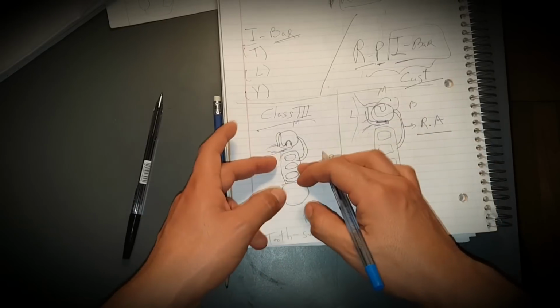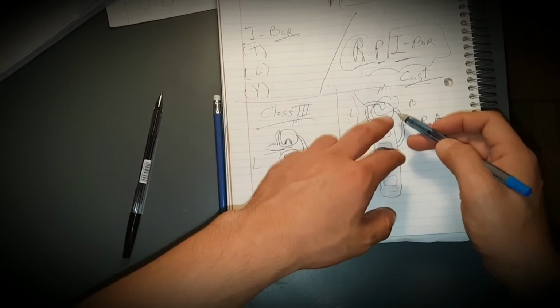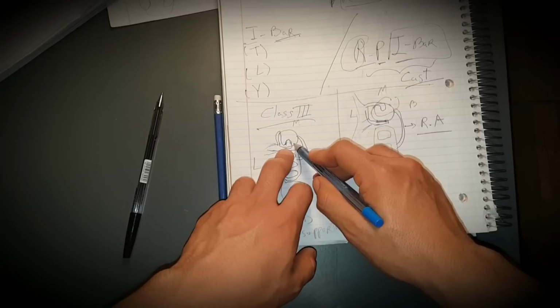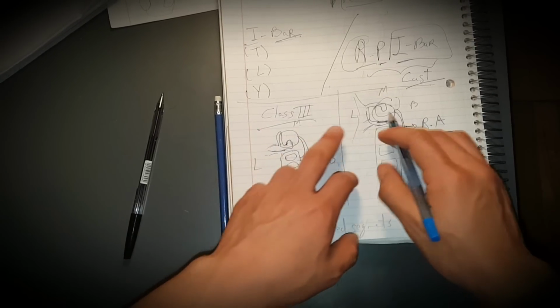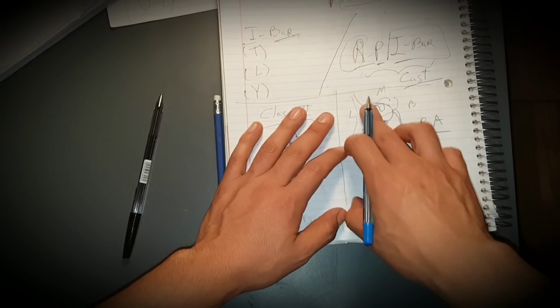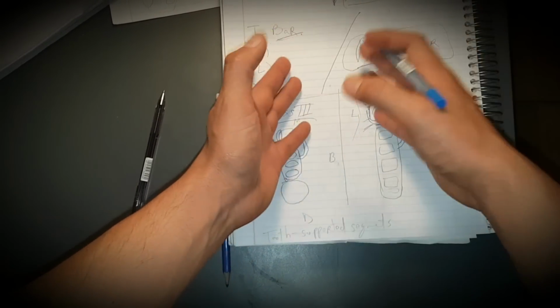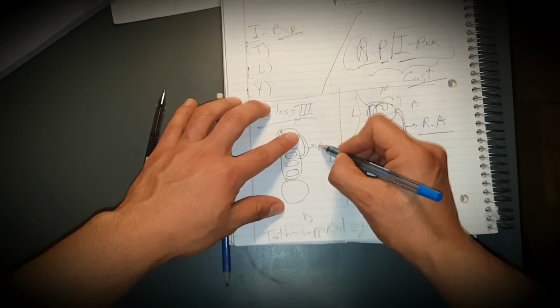So, this is not an RPI, because the R means that the rest is in the mesial. We still have the guiding plane, but here the rest is in the distal. I have a reciprocal arm here, the minor connector, and this portion plays the role of the reciprocal arm in the design of an RPI, with the I bar included there, because the I bar is just a retentive arm.